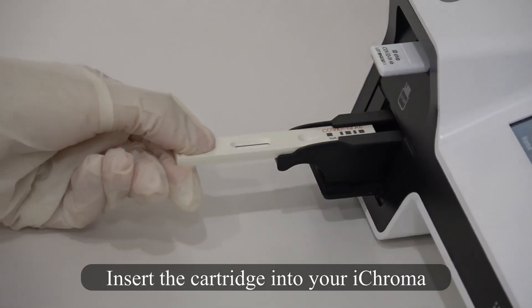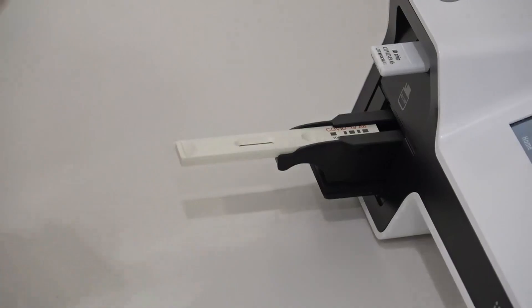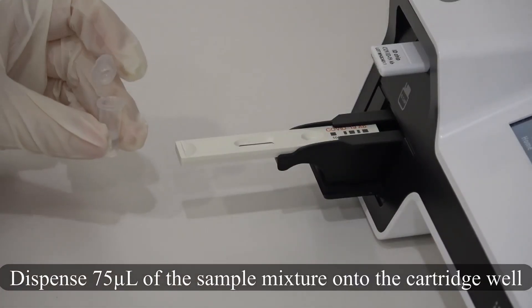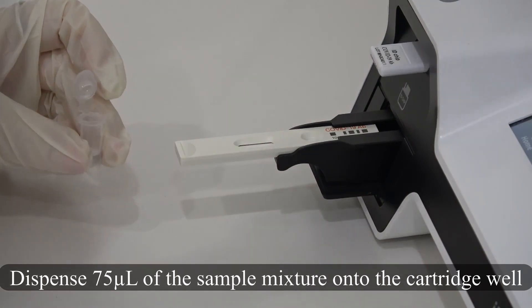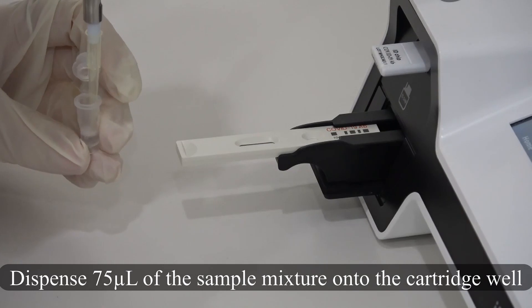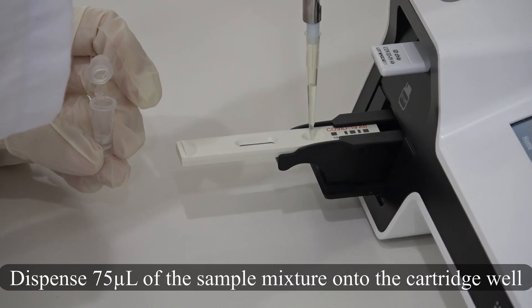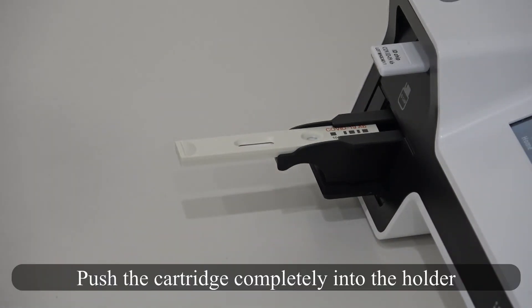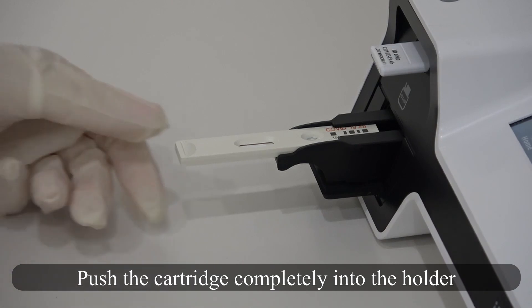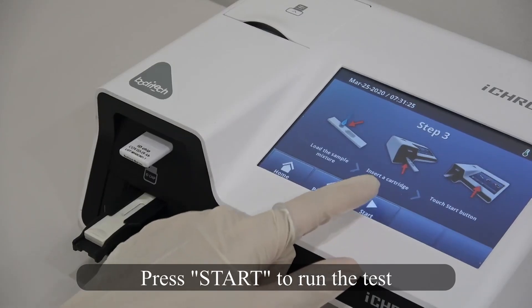Insert the cartridge into your iChroma. Dispense 75 microliters of the sample mixture into the cartridge well. Push the cartridge completely into the holder.